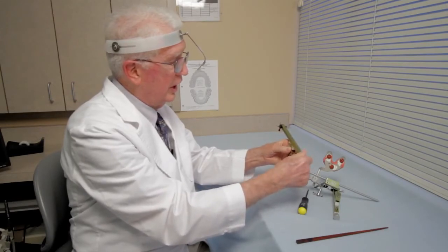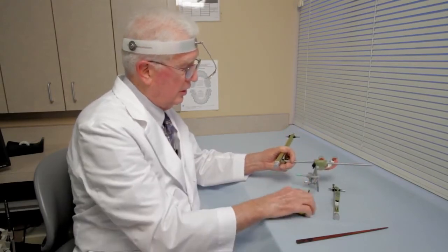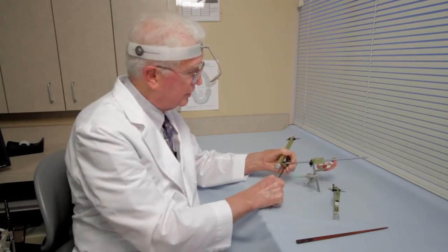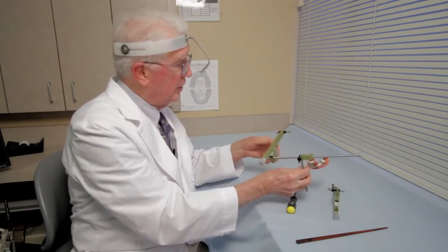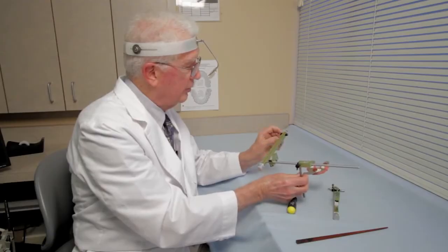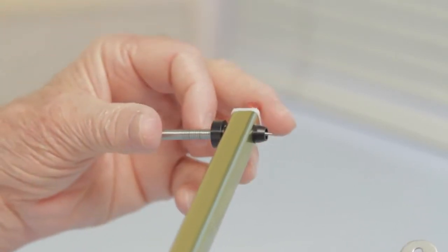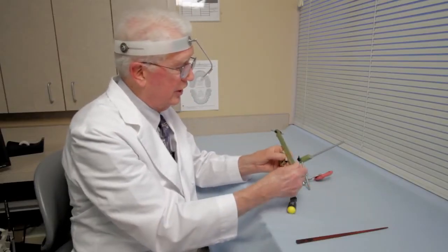And then I could place the side arm on the crossbar, tighten it, move it in until it touches the patient's cheek in the area of the hinge axis mark. Tighten it. Then reverse the pen so that the point is now toward the patient. And for the moment, I will put the left side on, and I'd be doing exactly the same thing. I would make gross adjustments on the left side.